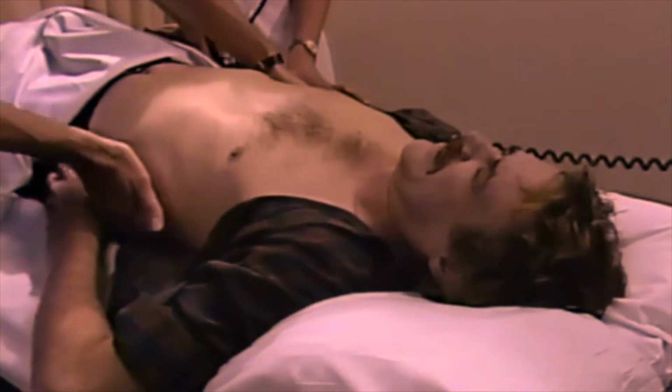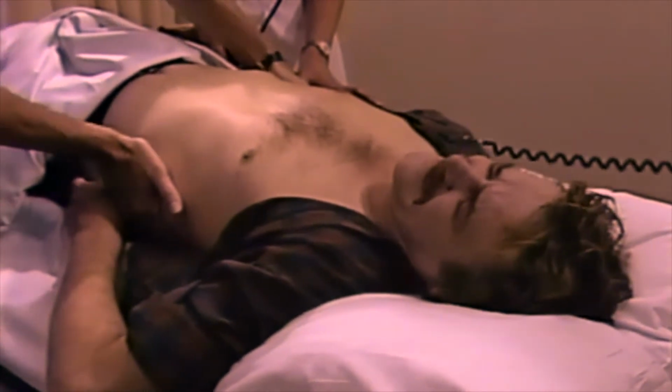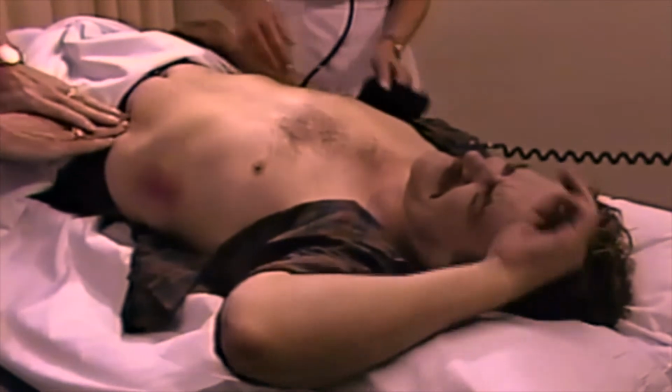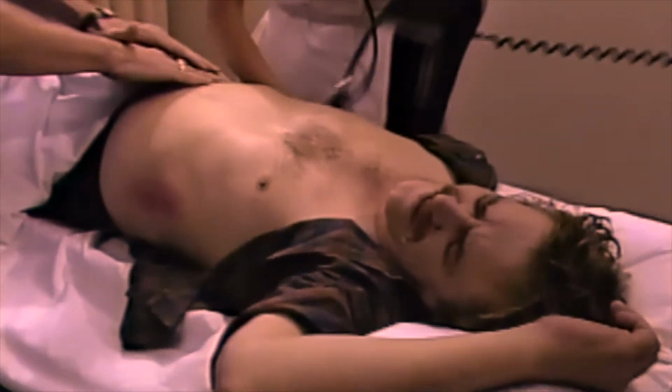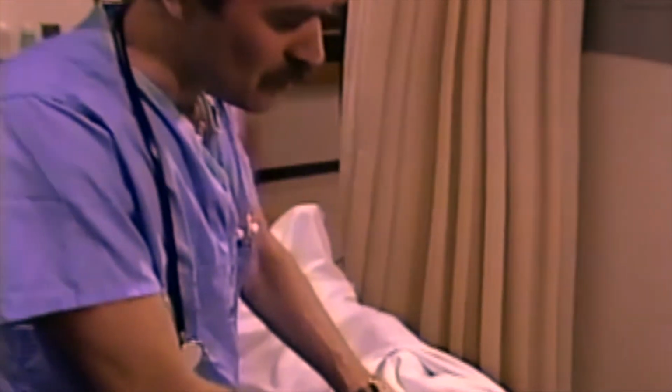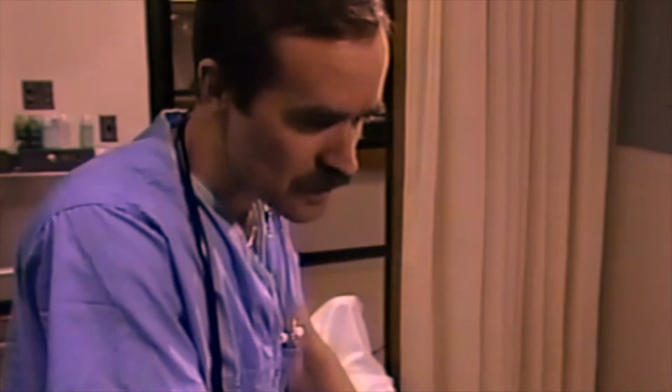Let me see. That hurts there? A distended abdomen and some rebound. How's his pressure? Patient's getting a little shock. The pressure's 100 over 60. All right, let's get an IV started. D5 half normal. We may have a pulsatile mass here. Put a call into ultrasound and get one of the radiologists on the line for me.